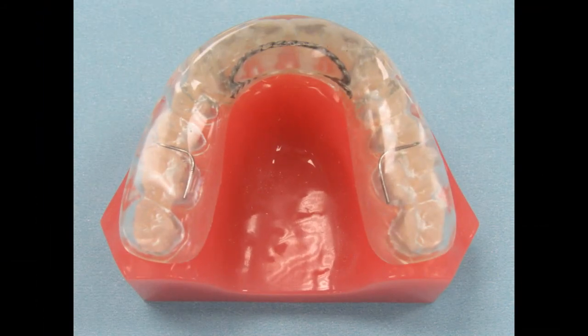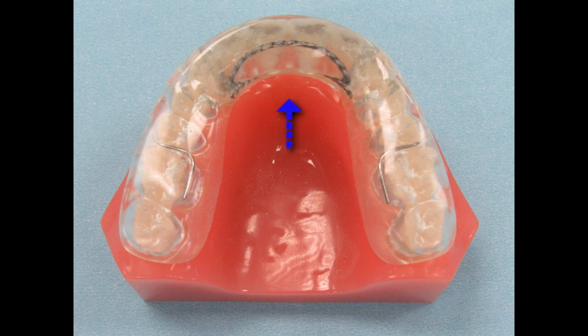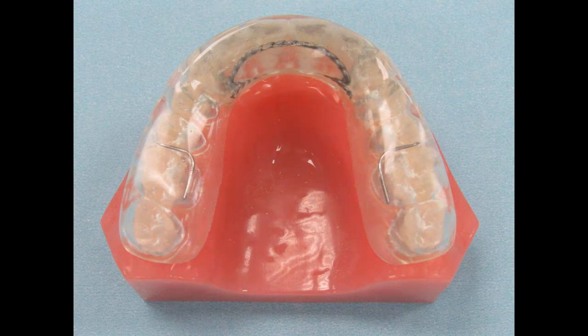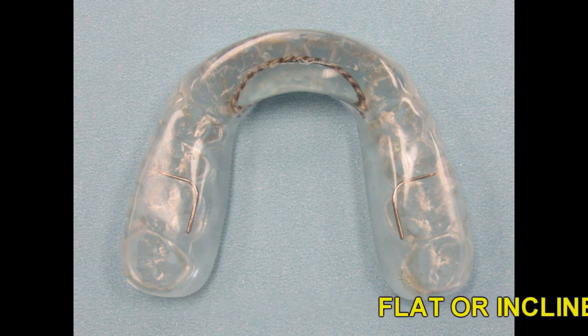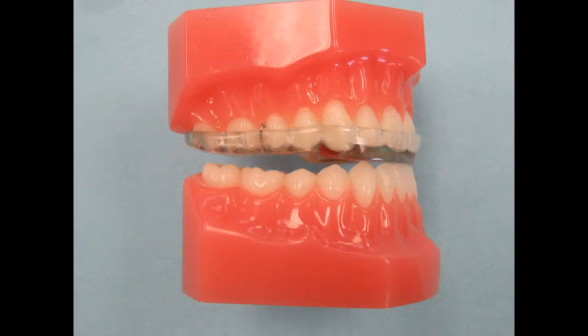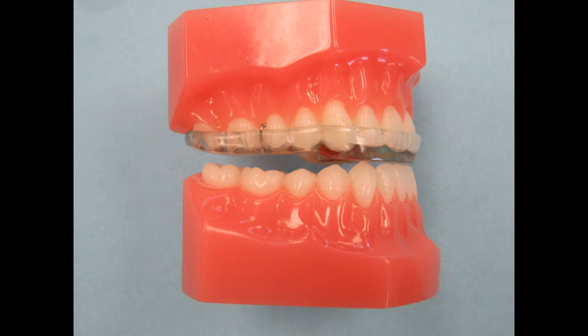One of the first options for some TMJ patients is an anterior deprogrammer. This appliance is worn on the upper arch and can be made of all-acrylic or a hard-soft combination. An anterior bite plane is placed to open the vertical so the patient's posterior teeth do not touch — the only teeth contacting the deprogrammer are the lower anterior teeth. The bite plane can be flat so the mandible can slide around to find a pain-free position, or it can be inclined to open the vertical and reposition the mandible forward. This appliance is only worn at night, and it prevents the mandible from compressing the joint as the patient sleeps. It can also be a very effective night guard to protect the teeth from bruxing and grinding. Some patients will wear a splint during the day and a deprogrammer at night for optimal relief and positioning. Please let us know if you'd like a flat or inclined anterior bite plane when you send us this case.